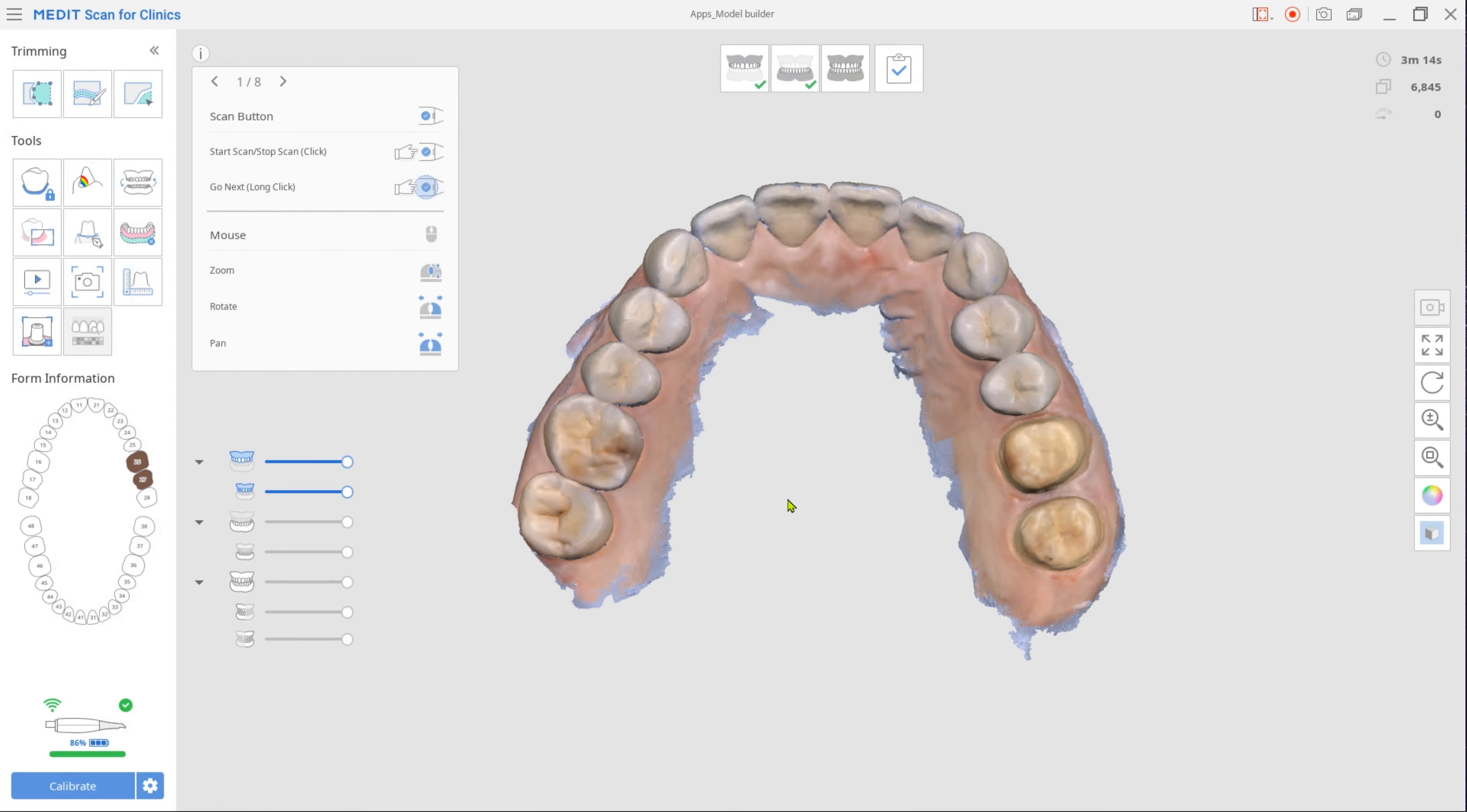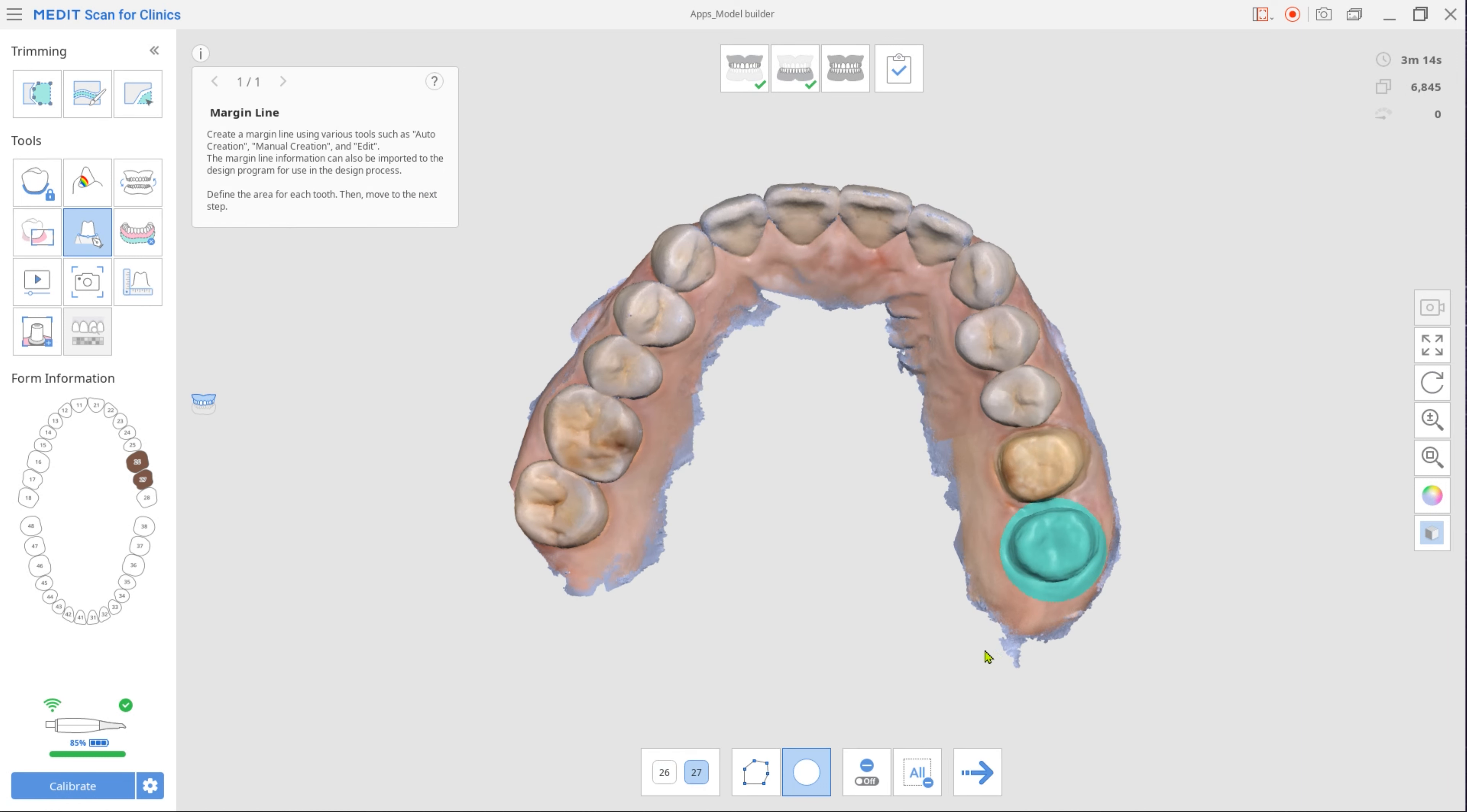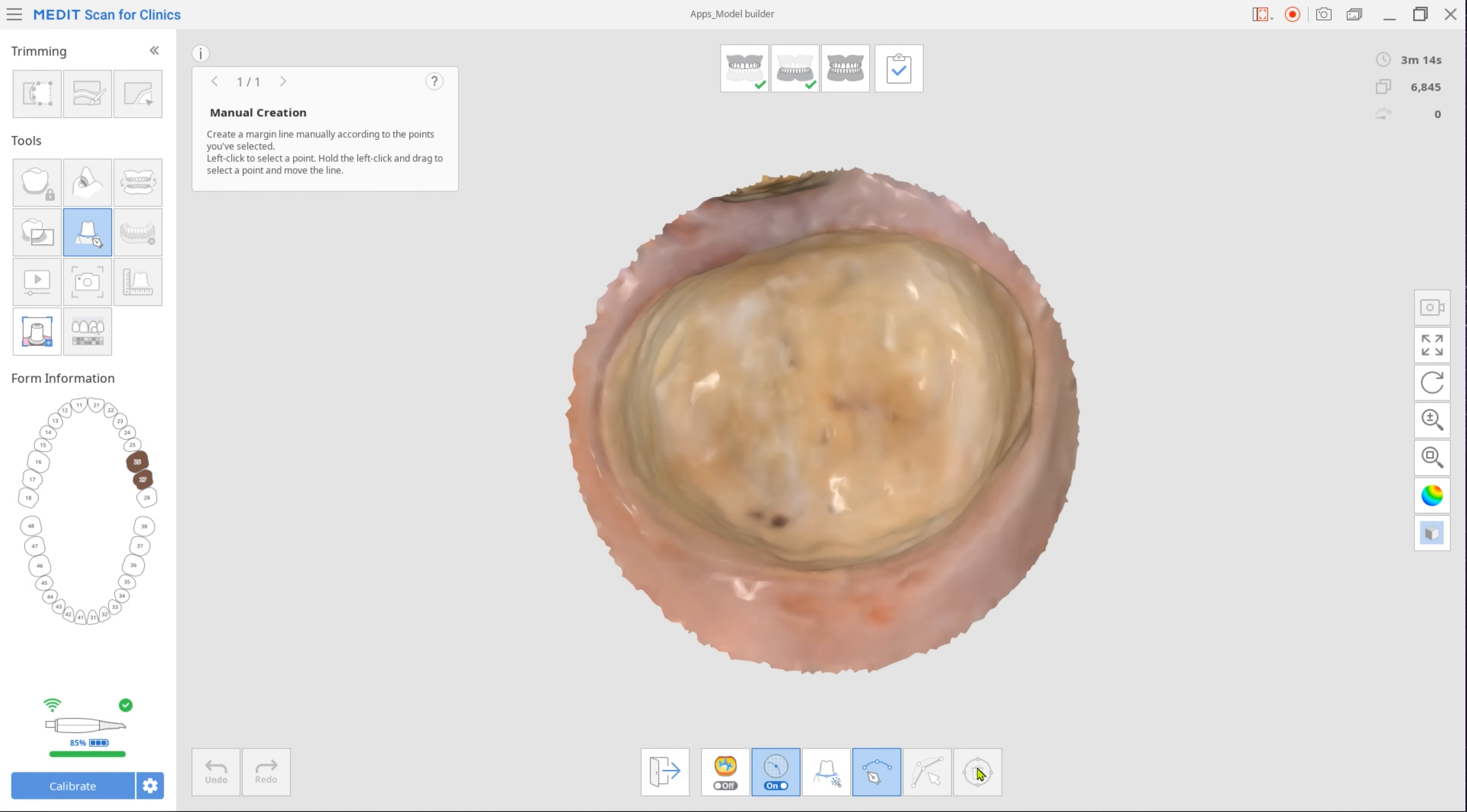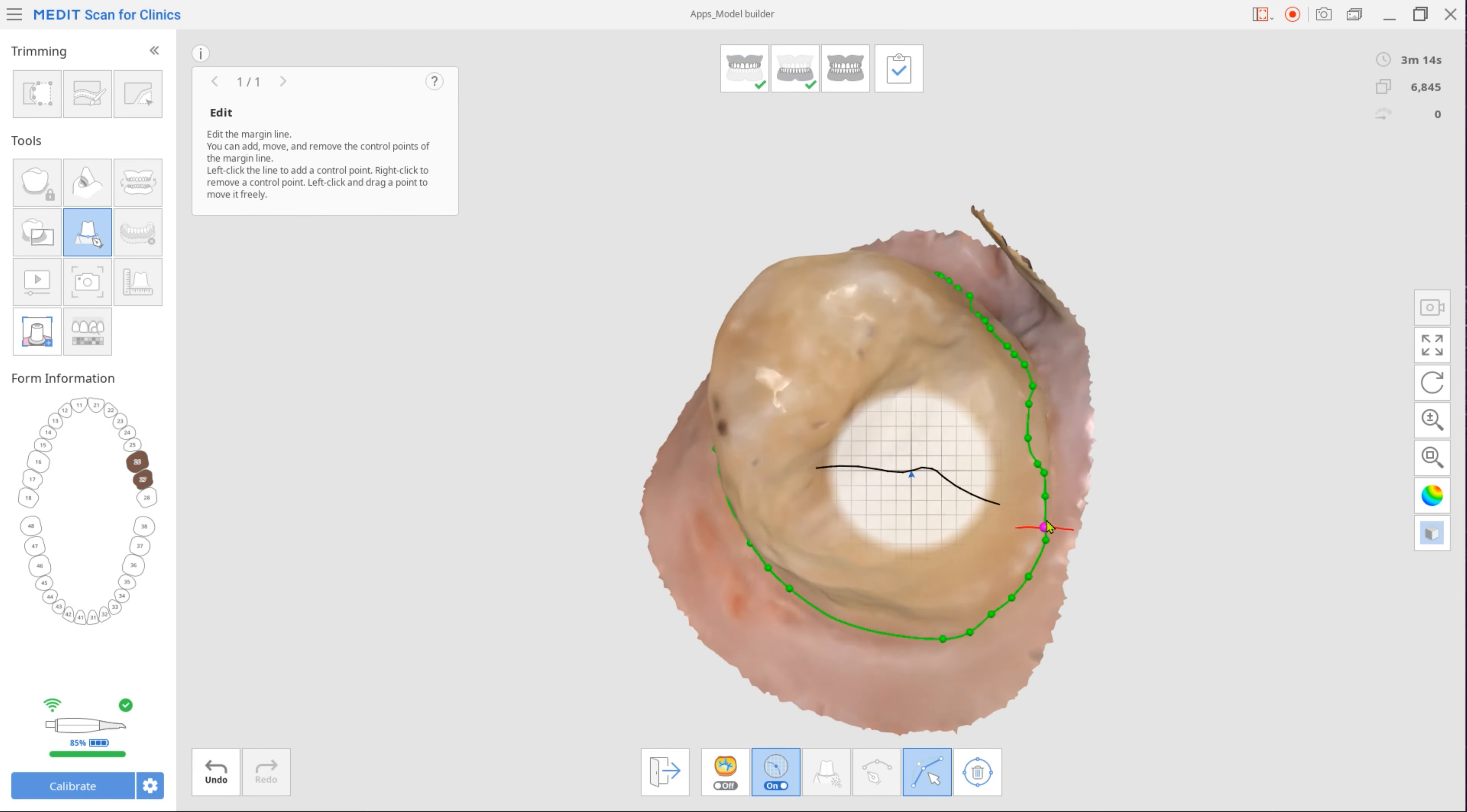A tip here is to create margin lines right in MeditScan for clinics so they could be later automatically imported to Model Builder.